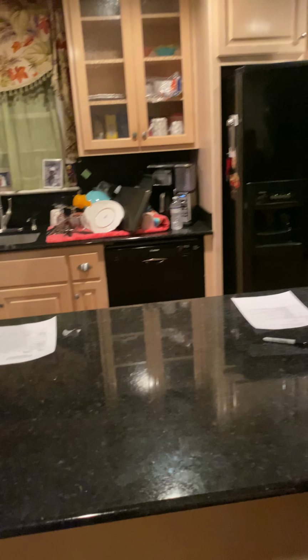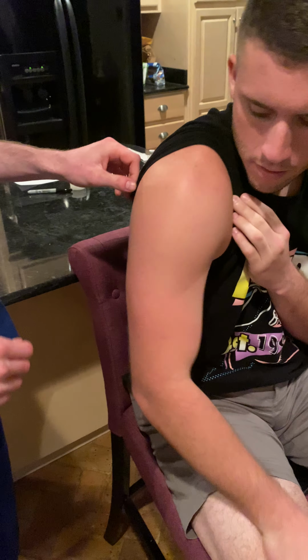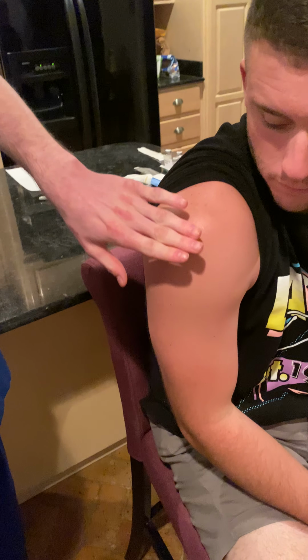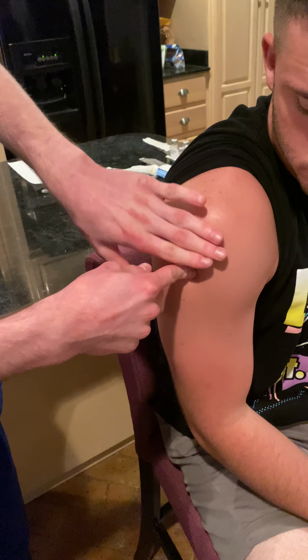So then I will move on to sites for injection. So the first site is the deltoid site, and I will locate the acromion process, which is right here, and it forms the base of the triangle. And if you go 3 fingers down, the injection site will be right under the 3 fingers in the middle of the triangle.